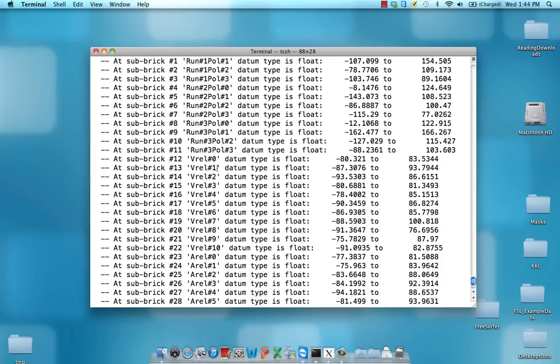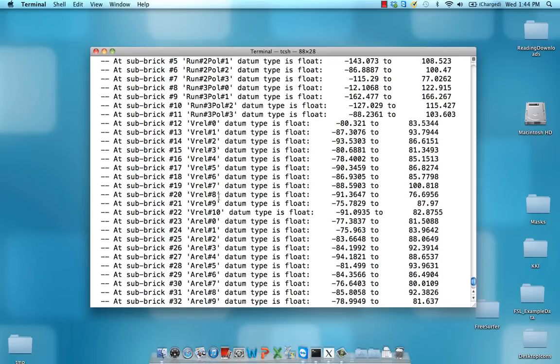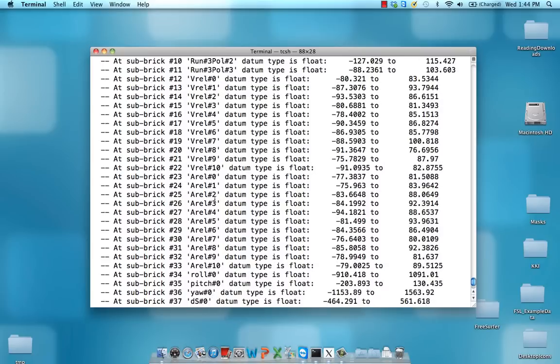At time point zero, one, two, three, four, five—and these correspond to my TR or my sampling rate. So it's zero seconds, two seconds, four seconds, six seconds after that stimulus response. You can use it to capture as wide of a window as you want. Obviously the more time points you're trying to estimate, the less power you're going to have in your model.